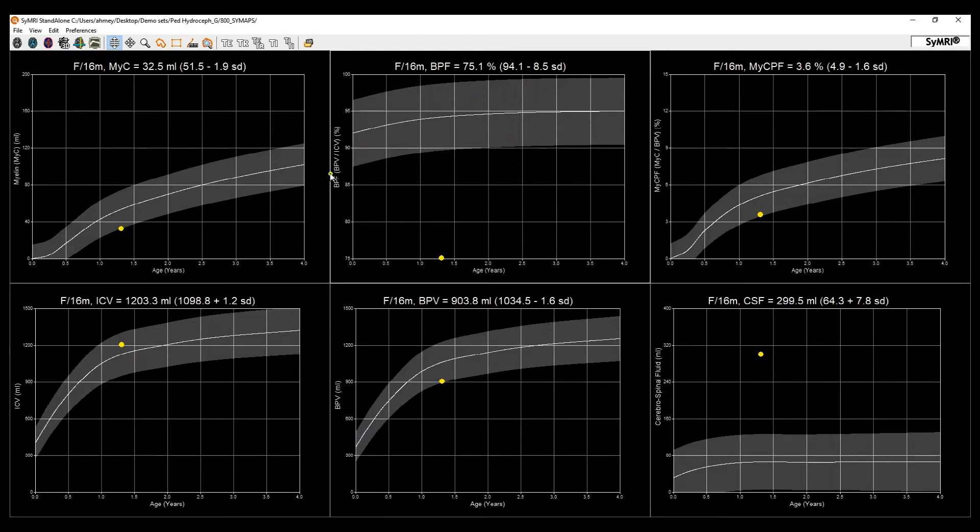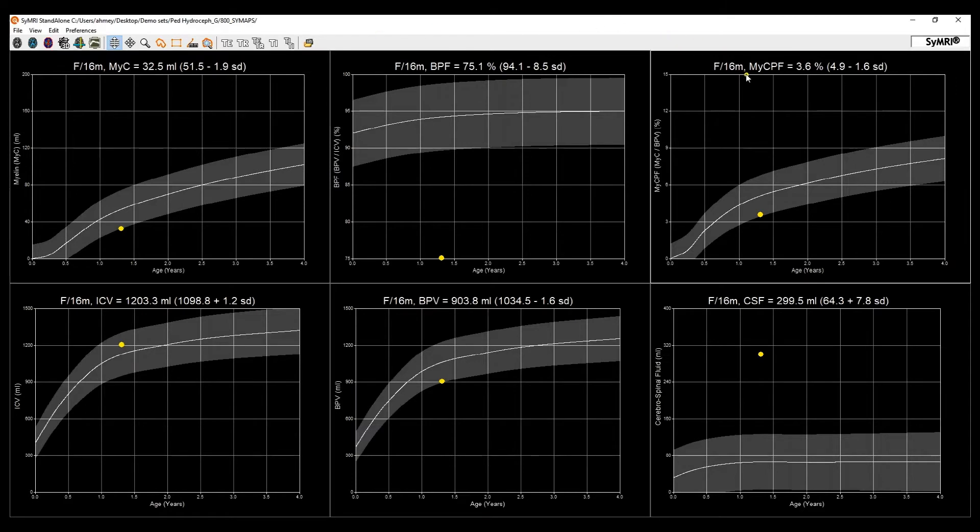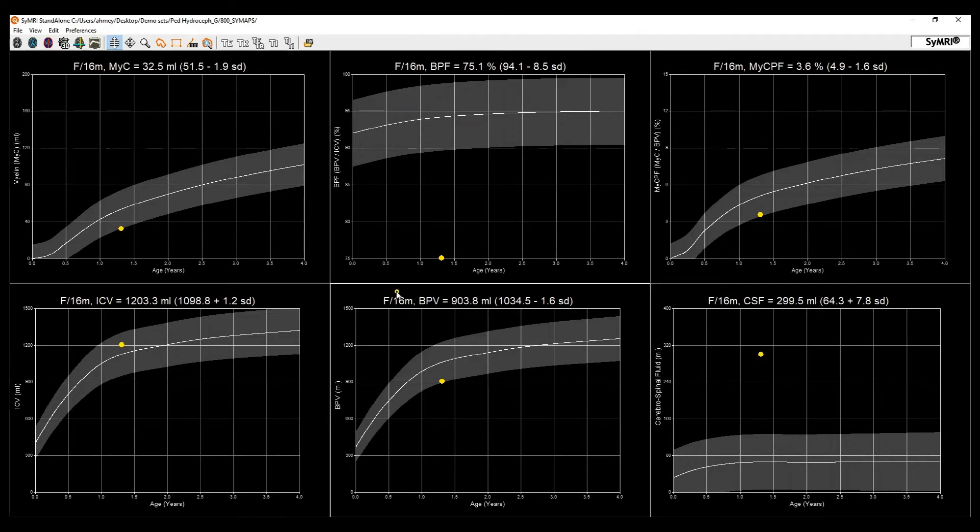Of course, what's more, you have the myelin content in the top left, the myelin parenchymal fraction in the top right, with the intracranial and brain parenchymal volumes in the bottom left.